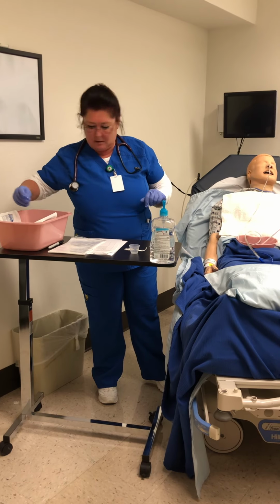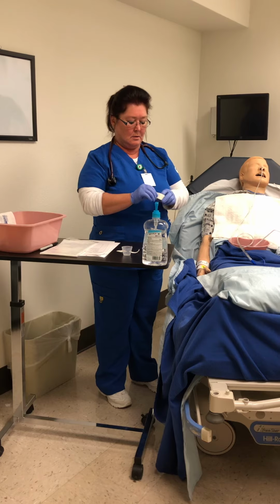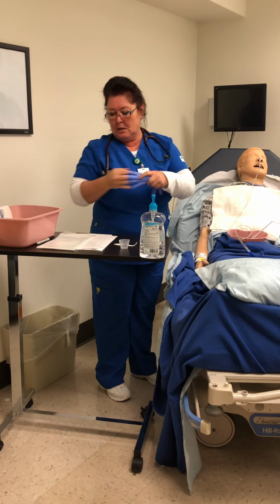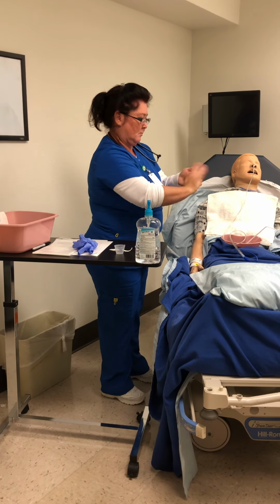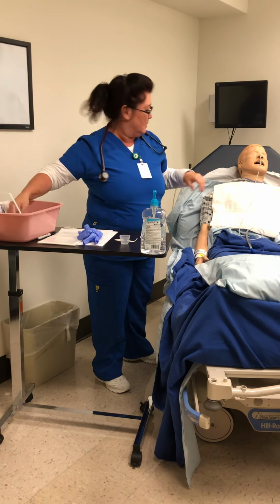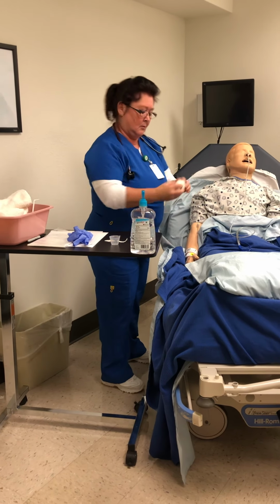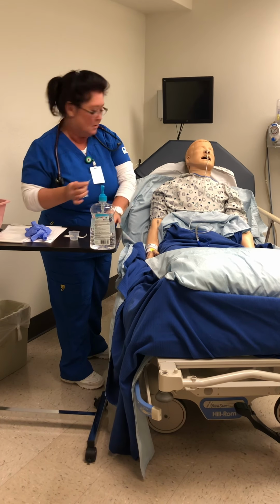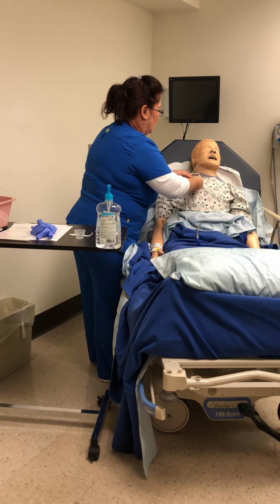And next, I'm going to secure, actually take my gloves off, and I'm going to perform hand hygiene. And take away her emesis basin and her cup and her towel. And I'm going to get some tape. We are going to wrap this around the tube so that we can secure it to her gown so that it doesn't go anywhere.